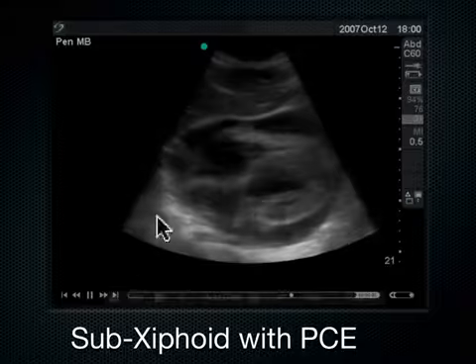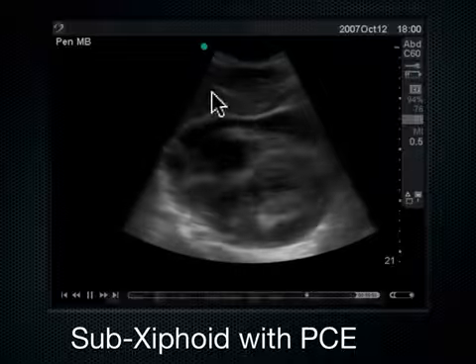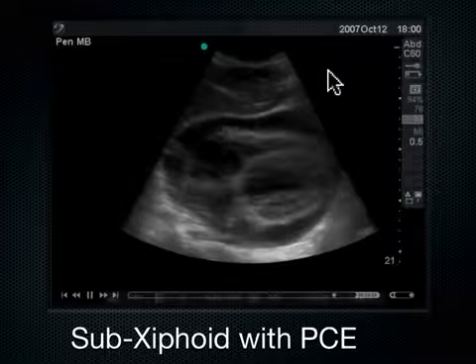We can make out all 4 chambers. We're using that liver. We see a lot of liver at first, and then we go into the subxiphoid notch where we see more of the apex. Without this liver, you cannot see the heart in a subxiphoid approach. So someone who's got a very small cirrhotic liver, you can't get these windows.